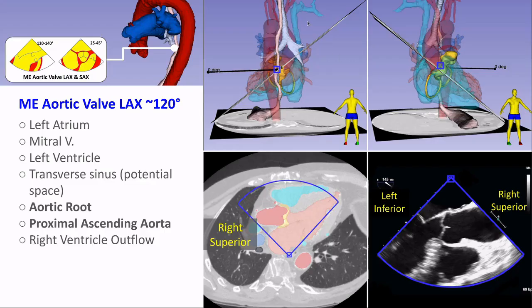Next we have the aortic valve long axis view, obtained from the long axis cut plane. Here you see the aortic root and proximal ascending aorta, the sinotubular junction, and it's a good view to assess for aneurysms, dissections, functioning of the aortic valve, and aortic insufficiency.